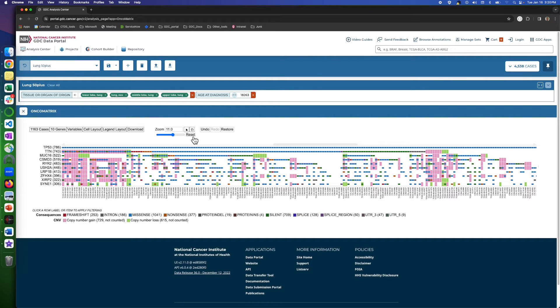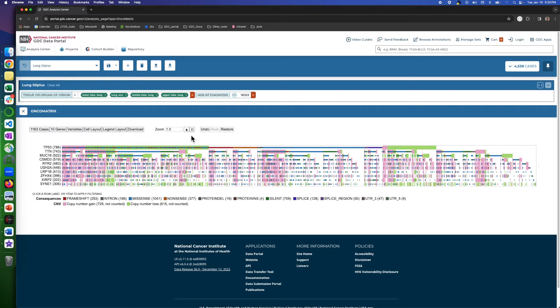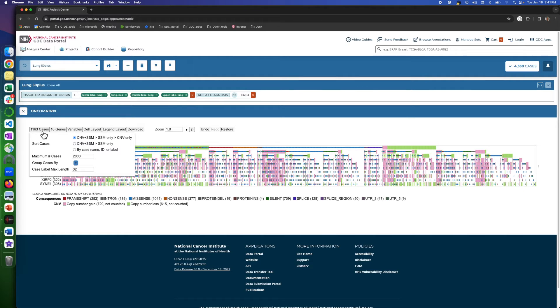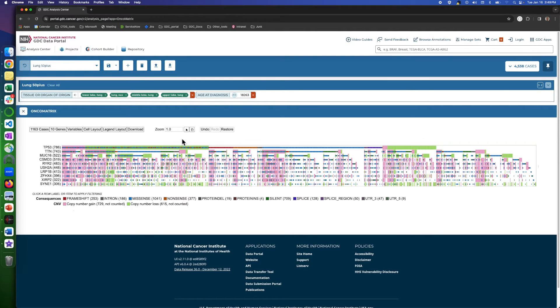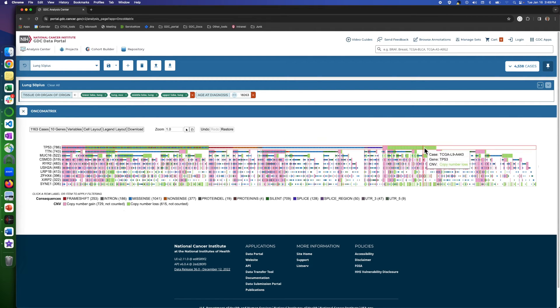You can also click reset to go back to the default view. Back to the cases button, we have a few features here. The sort cases option lets you set the grouping hierarchy based on whether the data contains copy number variation (CNV), or simple somatic mutation (SSM), or both. When the first option is selected, the cases are grouped into with and without SSM, as shown by SSM narrow flags grouped. Grouping by having CNV or not will be nested inside SSM groups.